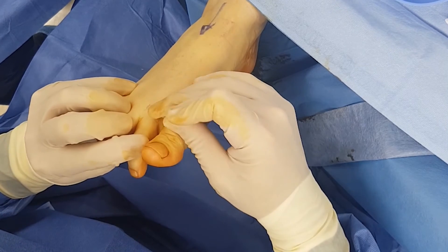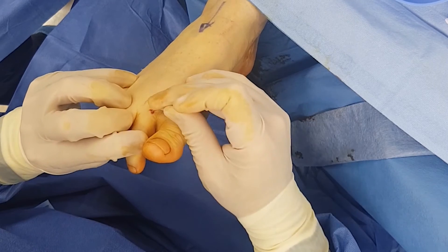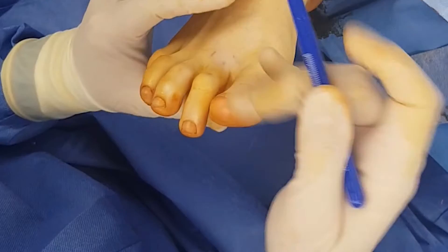It's so much easier to correct deformities at this level when they're flexible, because once again it's just a soft tissue procedure, and there's no reason to perform any osteotomies at the metatarsal or the phalanx.